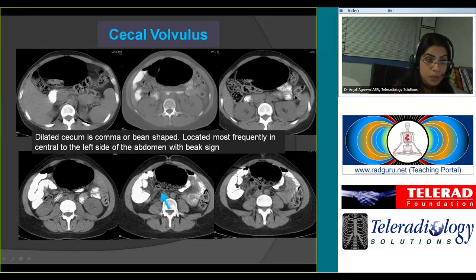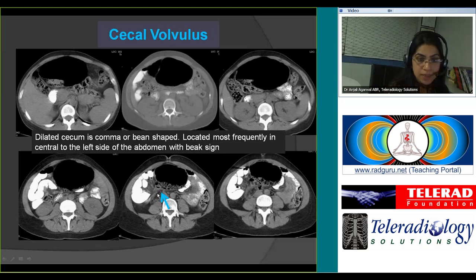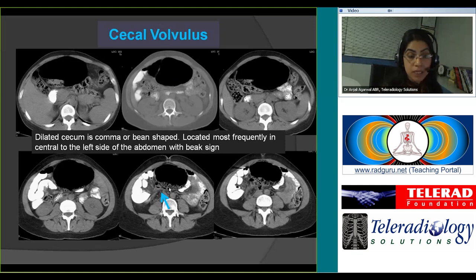Cecal volvulus is also a type of closed-loop obstruction. The dilated cecum is located in an abnormal position — almost to the left side of the abdomen. When diagnosing volvulus or bowel twists, look for the 'beak sign' — beaks result from compressed bowel at the point of the twist — which helps diagnose volvulus and differentiate it from a markedly redundant dilated sigmoid colon or sigmoid colon with ileus.